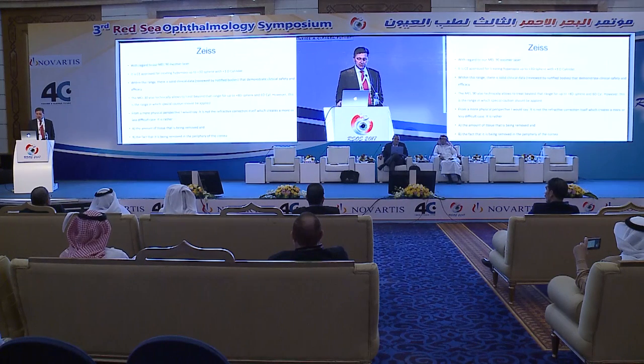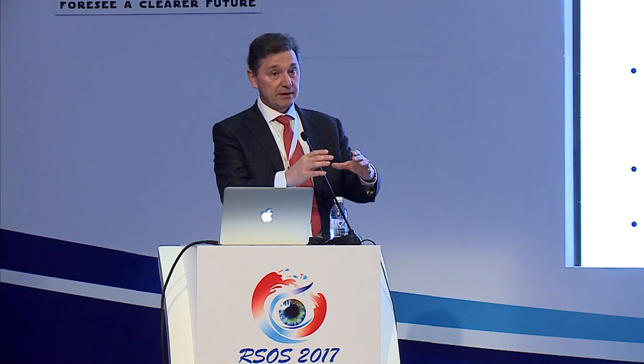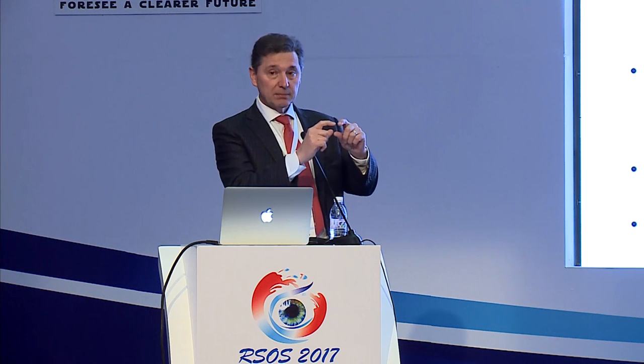If you look at it, the Zeiss laser is approved to plus 3. Yet most of what we know about epithelium and the effect of epithelium after hyperopic LASIK comes from Dan Reinstein. Reinstein, on a regular basis, has 500 cases of hyperopic LASIK over plus 6, but he does it using epithelium to tell him how far he can go. So when he plans a treatment, he tells the patient, we're going to correct most of your error. If the patient decides this is their best choice, they don't want a refractive lens exchange, we're going to correct most of your error that I think I can do very safely. Post-operatively, we're going to look at your epithelial map. If the epithelium is still uniform everywhere, we know this cornea can support this epithelium, and we can go another diopter steeper. If the epithelium is starting to thin centrally, we won't go any further.